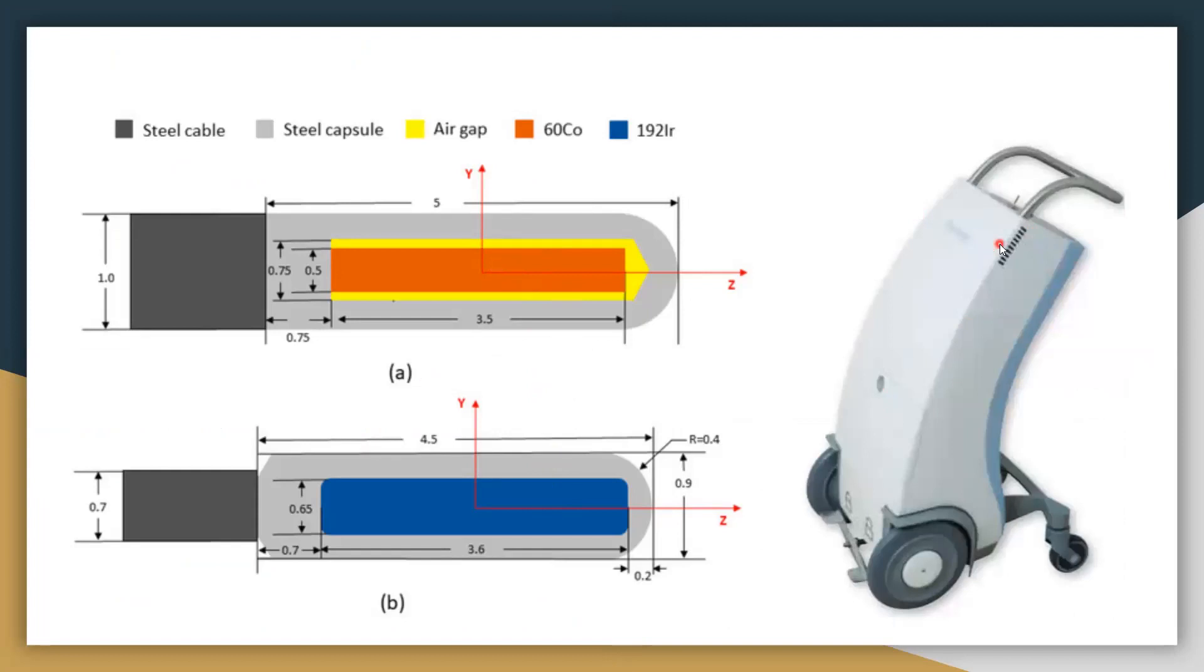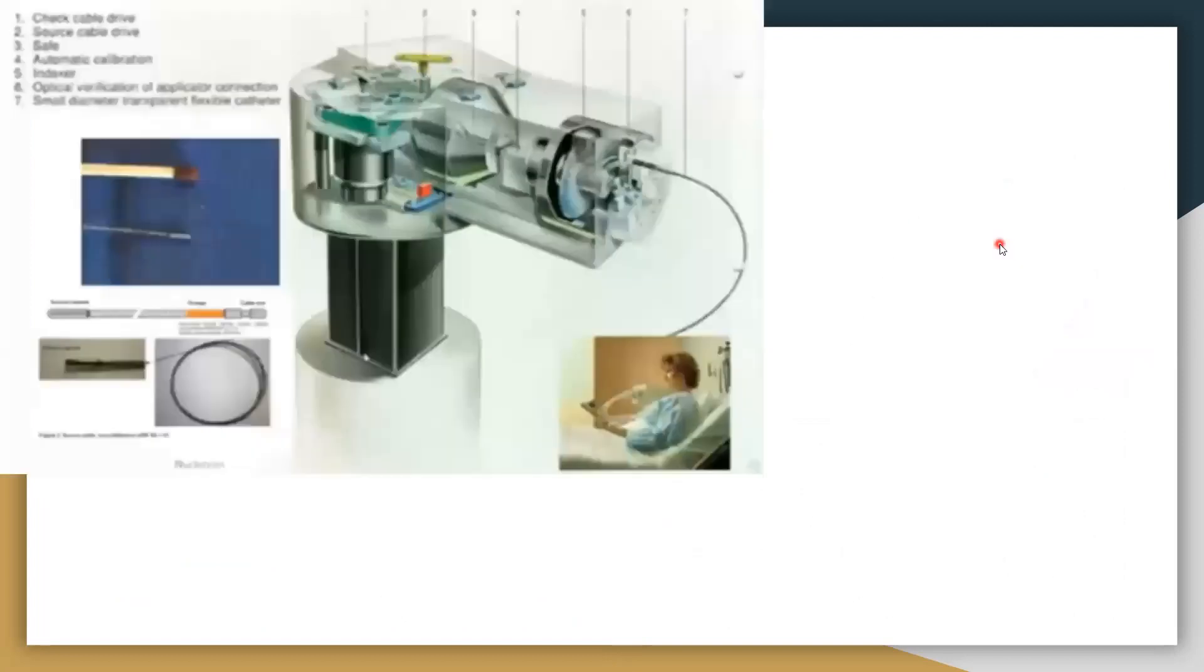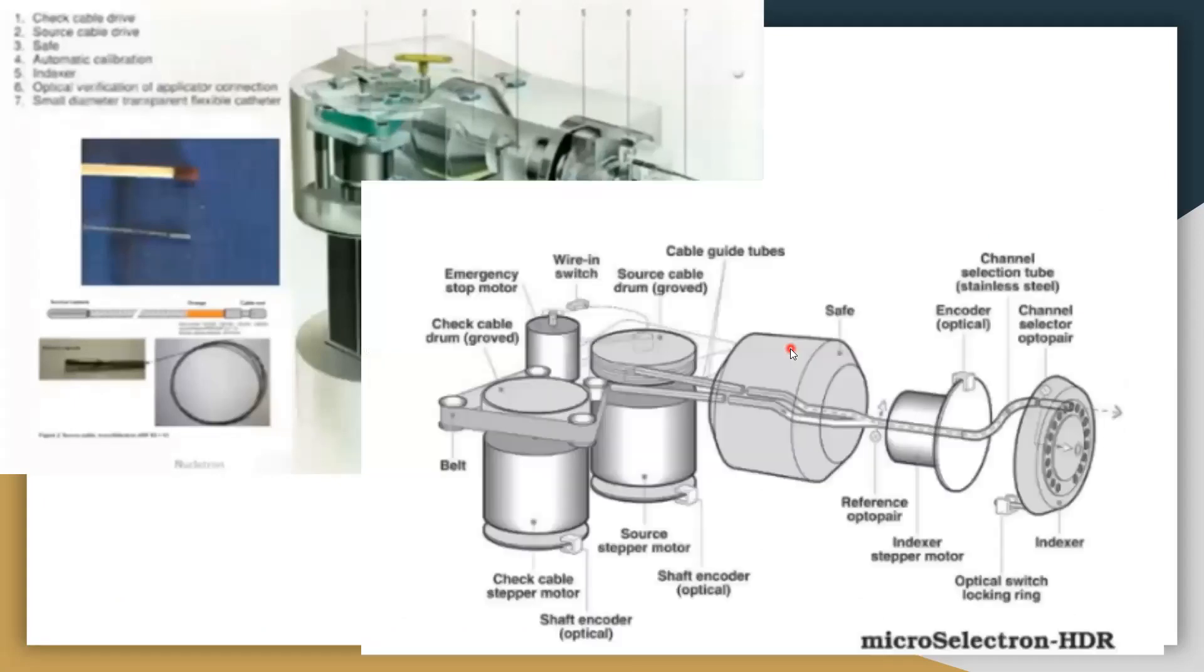This is the afterloader machine. This is the inside of the afterloader machine. Very robust system. Wire switch, emergency stop motor is there. Guide tube controls the movement of the source inside the patient. And the safety feature is the first, the dummy source will go and check the path, and then the iridium source will come.